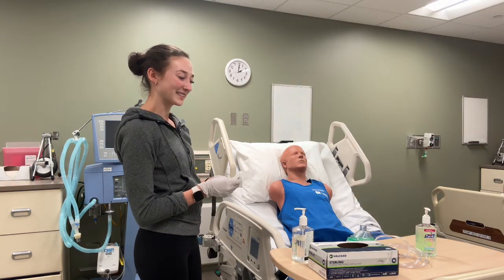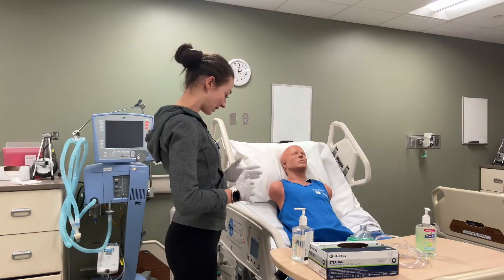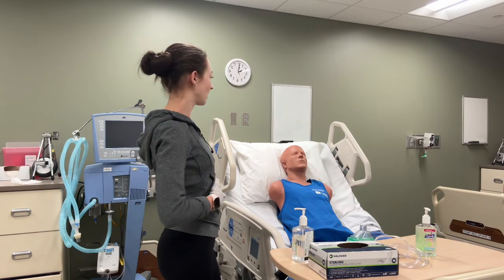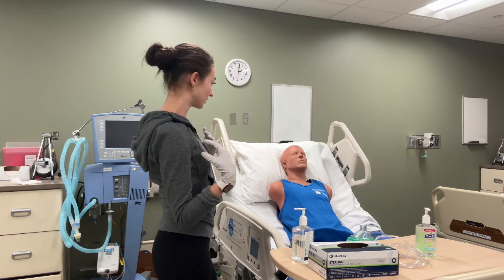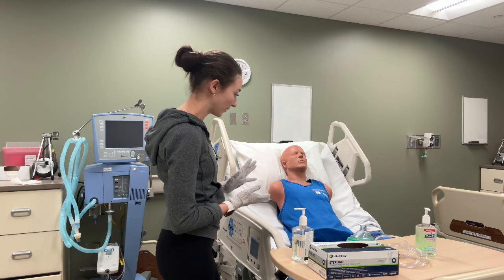And for diaphragmatic breathing, I'll have you put your hands on your stomach so that you can feel your stomach while you breathe. When you take a breath in, you should feel your stomach rise rather than feeling your shoulders rise as much. Do you want to show me that? Perfect.